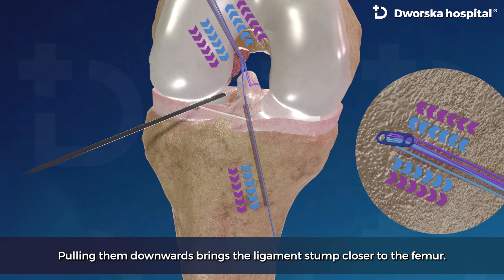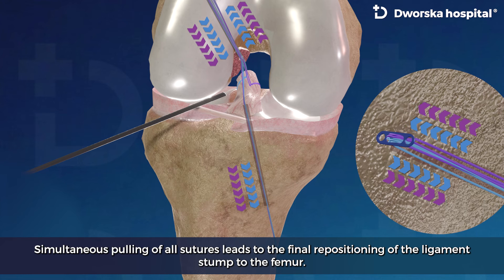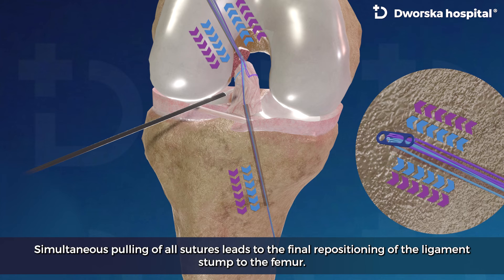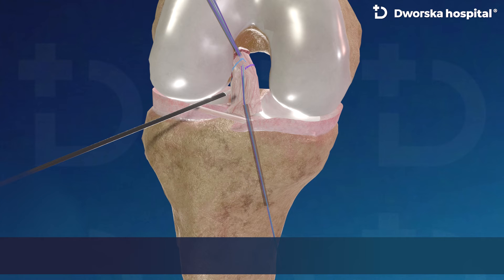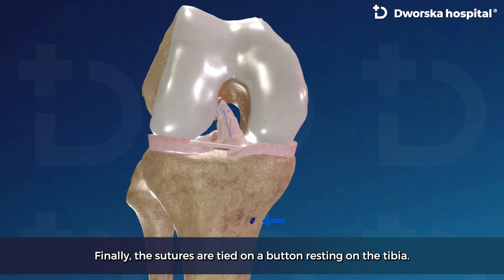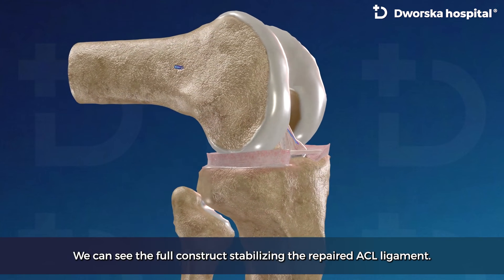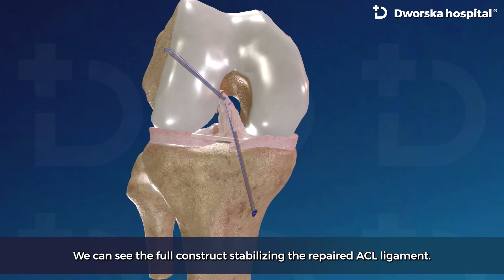Pulling the sutures downwards brings the ligament stump closer to the femur. Simultaneous pulling of all sutures leads to the final repositioning of the ligament stump to the femur. Finally, the sutures are tied on a button resting on the tibia. We can see the full construct stabilizing the repaired ACL ligament.